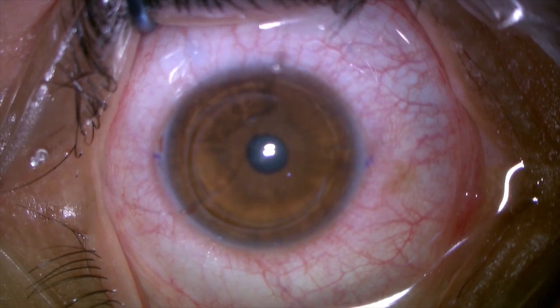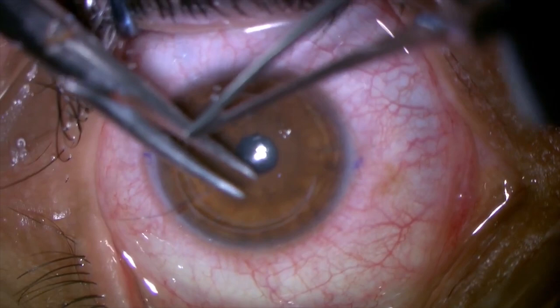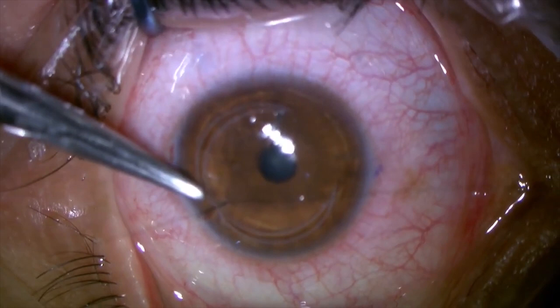It's very important to know that the depth is 90%. We don't penetrate the eye, just in the paracentesis in order to decrease the intraocular pressure. But the surgery, the femto, doesn't penetrate. And it's very important to get an apposition of the edges. We want both edges to meet. We don't want to exert too much pressure or too much tightness in the suture. We just want, again, the edges to come together.